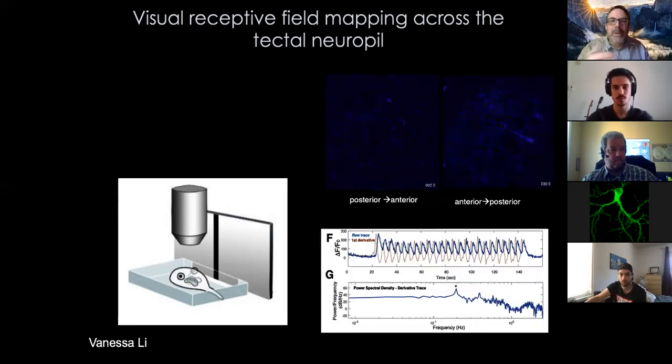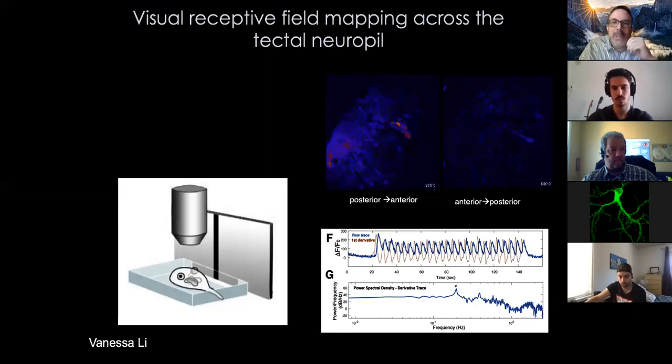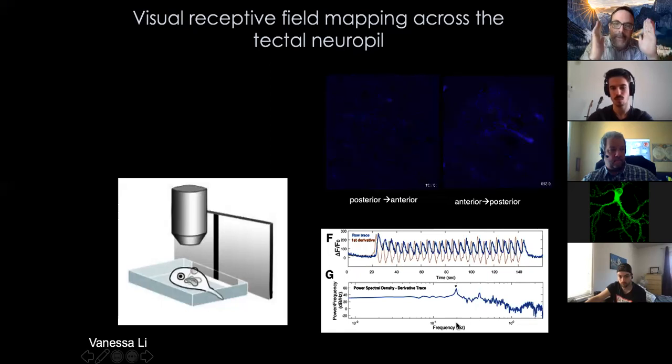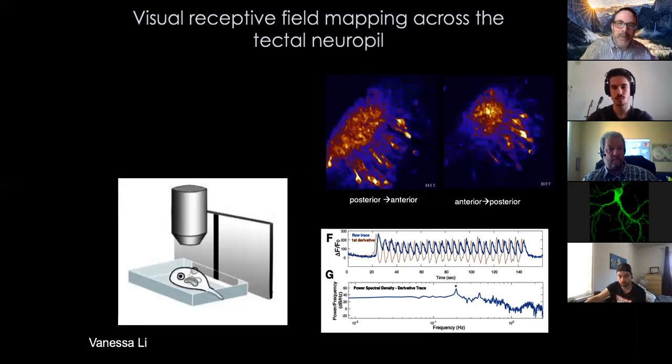And then for each voxel, we do a Fourier power spectrum. We pull out just the signal at the frequency of the visual stimulus itself, of the sweeping bar. And that is a great way of raising the signal to noise, so we're getting rid of any irrelevant responses. And then by looking at the phase at that frequency, it tells us where in the cycle the stimulus was. And that corresponds to the position in the visual field.